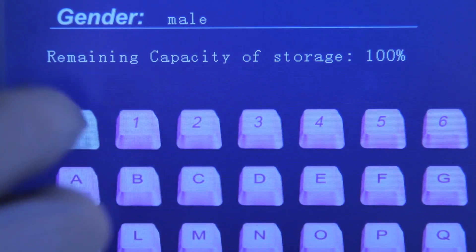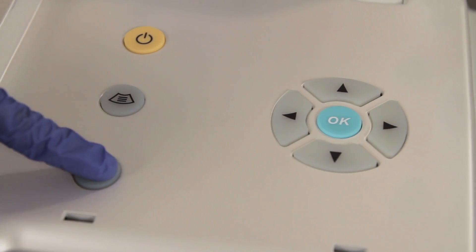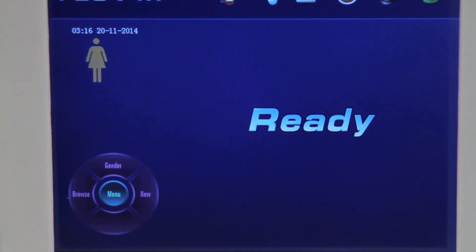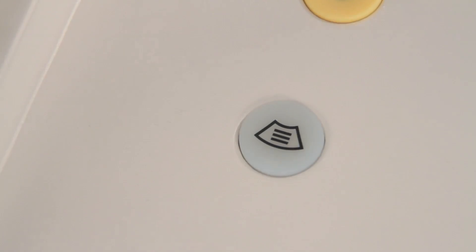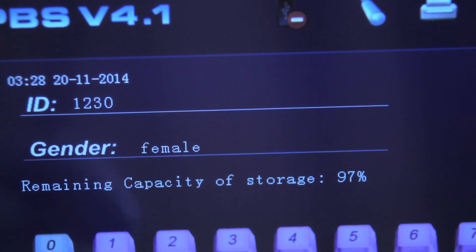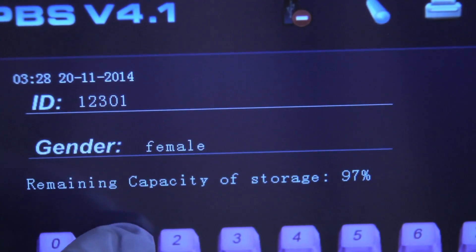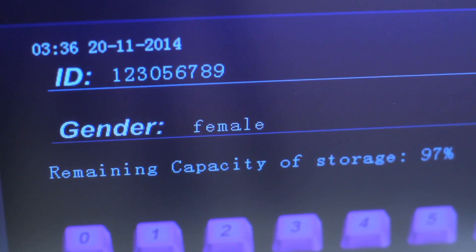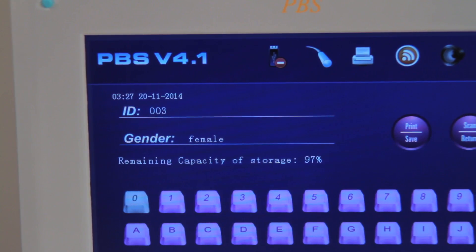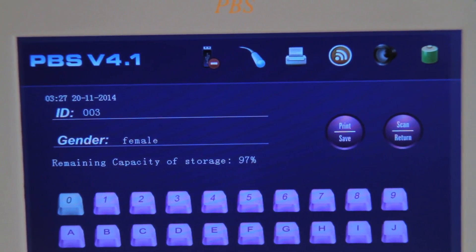You can use the touchscreen or the keys to enter the patient's ID. Press the Print key or Print touch key to save and return to the Ready screen, or press the Scan key to delete the saved information and return to the Ready screen. Note: patient ID may be up to 12 characters. Gender does not need to be input here — it is set in the Ready screen. Each patient ID is unique and specific to one individual; the same patient ID cannot be used for multiple patients.